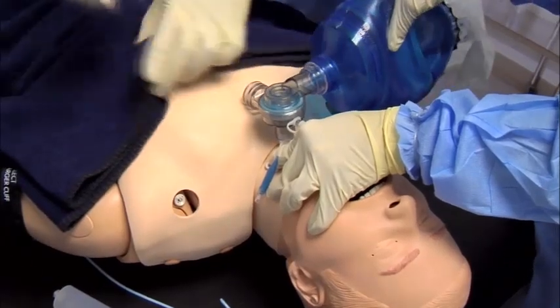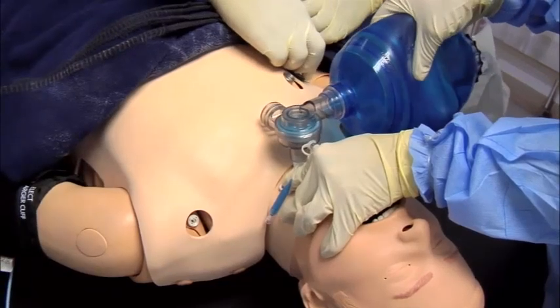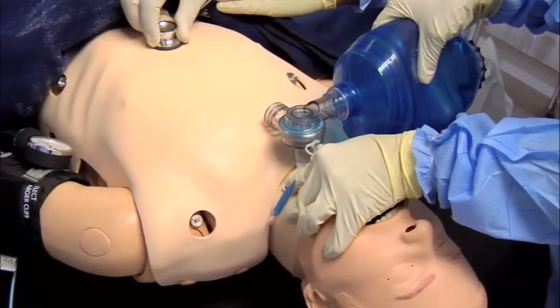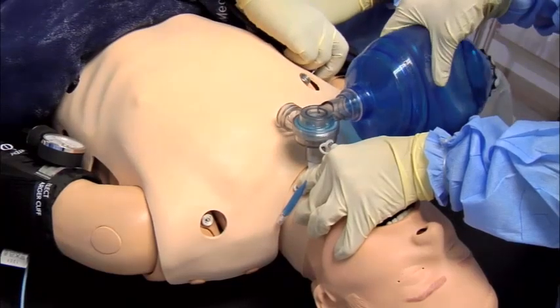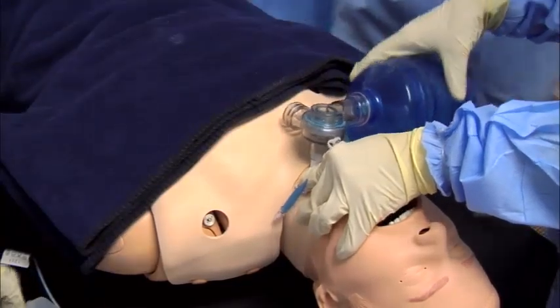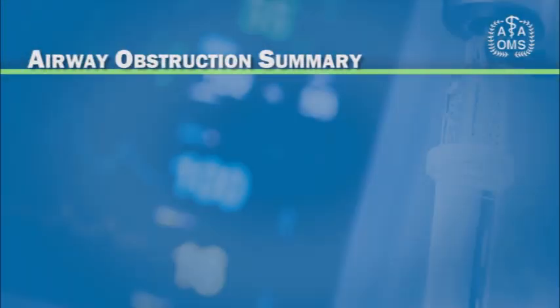I see chest rise. Do you hear bilateral breath sounds? Equal breath sounds bilaterally. Sounds good. Let's secure the tube. Okay.